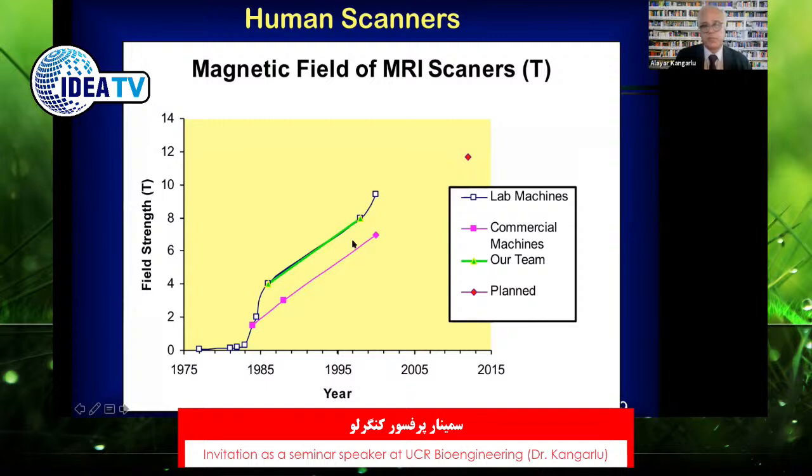But for that very reason, we did a lot of study on safety, and probably the most extensive work in our group at Ohio State between 1996 and 1998 was concentrated on safety, and I think that kind of opened the path and shed some of the concerns and phobia about MRI. And then the manufacturers decided that, while 4 Tesla was the standard of research, they would offer 3 Tesla for the standard of high field clinical scanners.